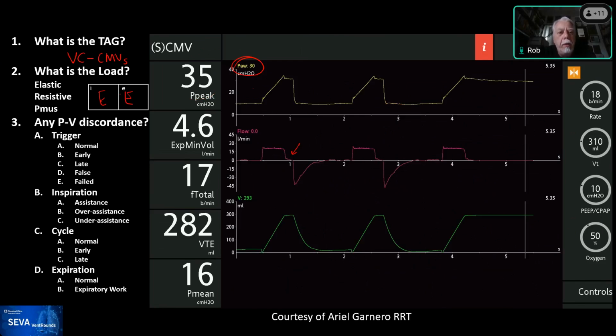I want to get back to this question about why there was not zero flow during the pause when the scope was in there. In this situation, would you expect that there would be a leak around the scope? Yep. So then probably what was happening is that the flow didn't go to zero because all that pressure compressed a lot of volume in the patient circuit. So even though the ventilator flow control valve was off, all that volume charged in the circuit was discharging through the leak. And it was going through the flow sensor, right?